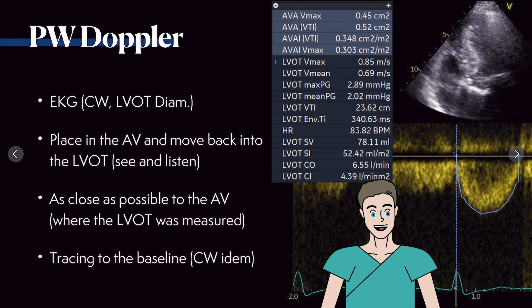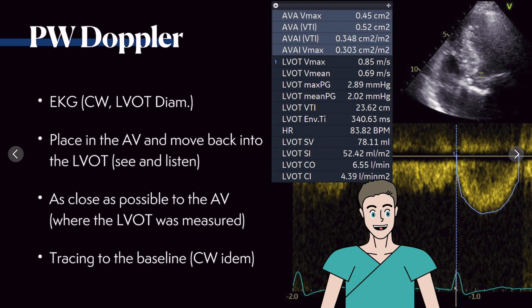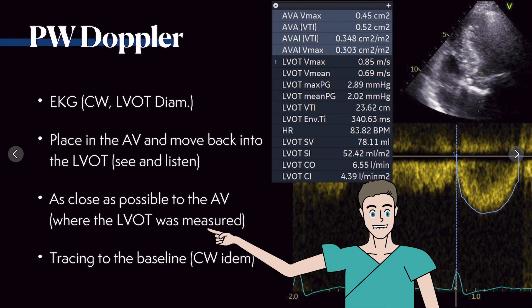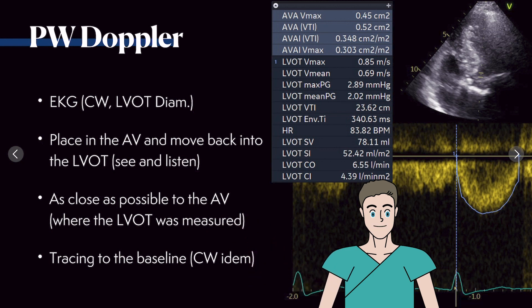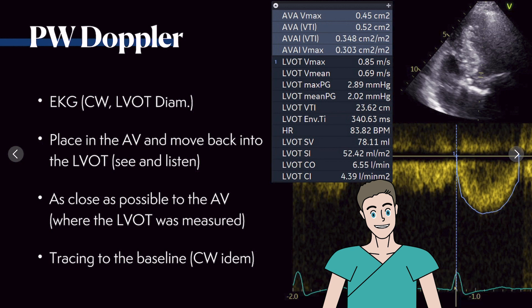Also use ECG guidance for the continuous wave Doppler, for the LVOT diameter, and also for the pulsed wave Doppler. As mentioned, you should measure as close as possible to the aortic valve, but really within the LVOT. And you should trace everything from and to the baseline, just like with the continuous wave Doppler signal.